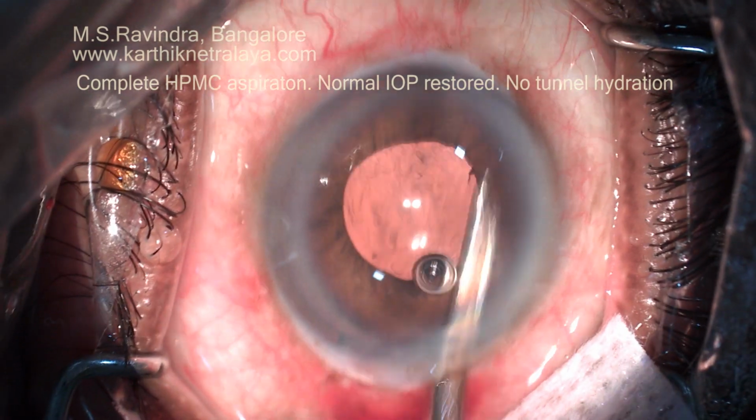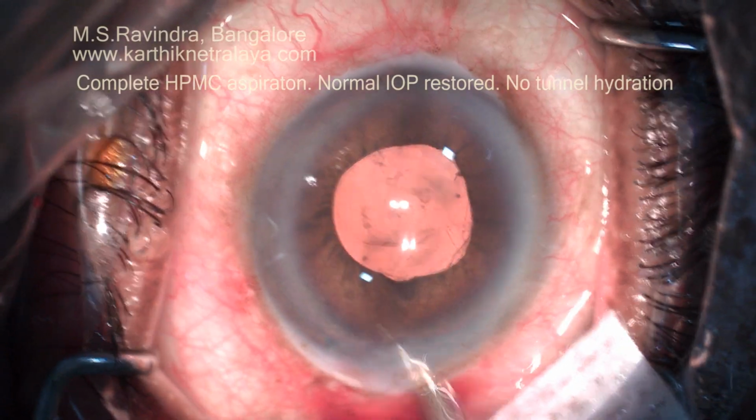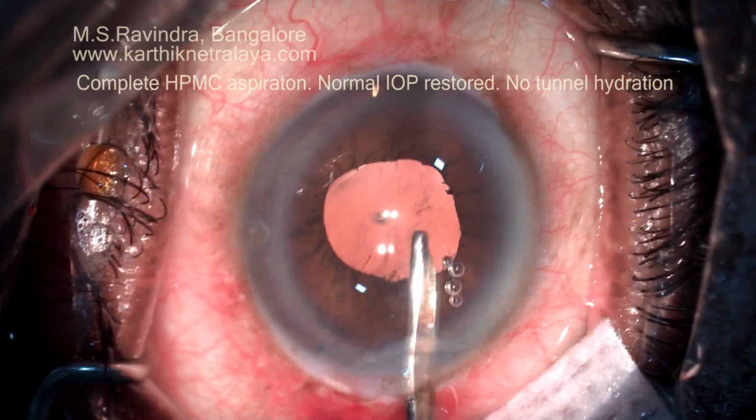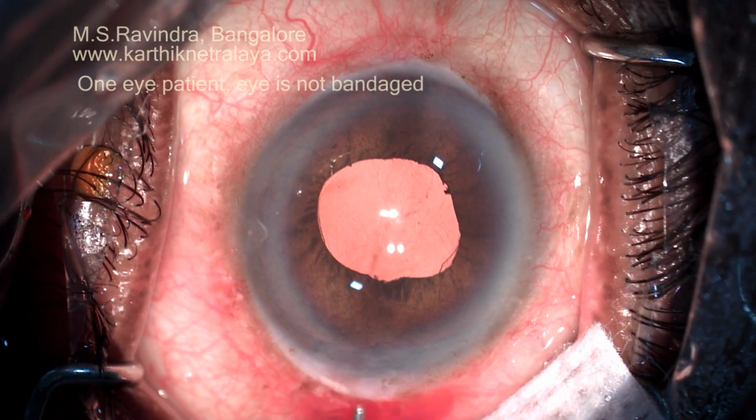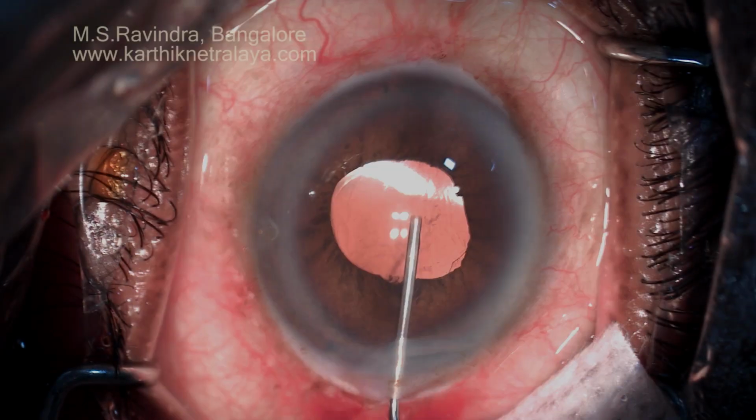Visco is aspirated completely from the capsular bag and from the angle region, and chamber depth is restored to normal intraocular pressure. The eye was not bandaged and was appreciated by the one-eyed patient.